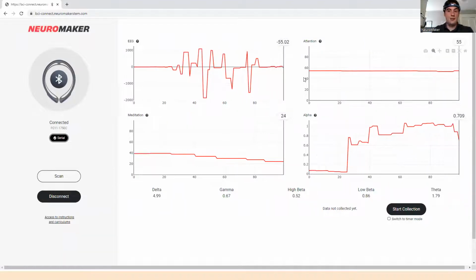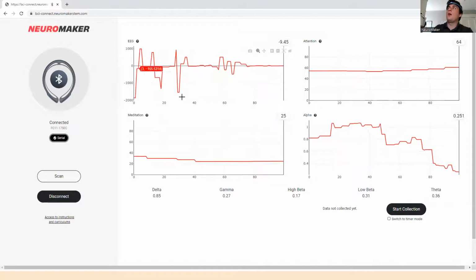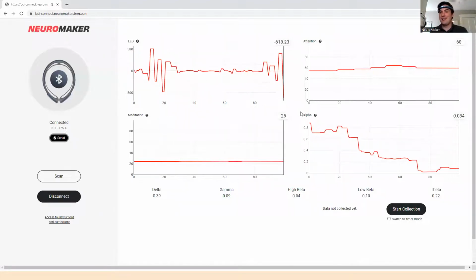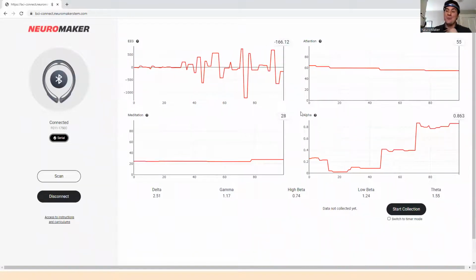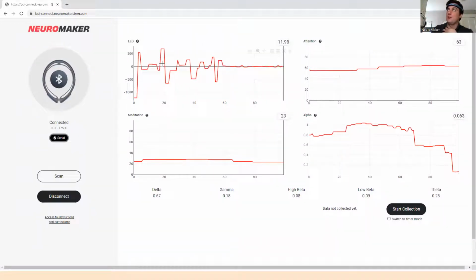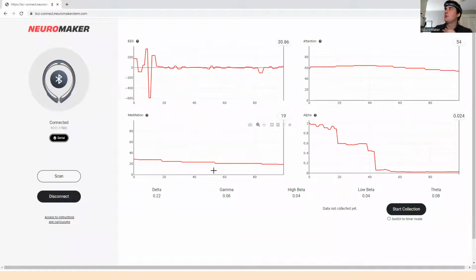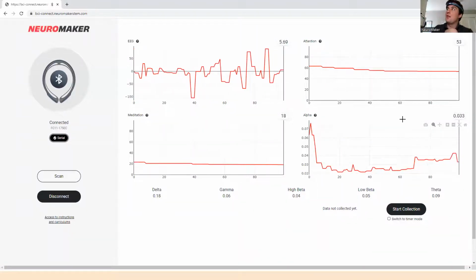So you can see there, you can see some distinct eye blinks, right? So there's all kinds of signals coming up in here. Of course, nobody's going to look at this and say, oh, I know exactly what's happening. So that's where we've spent a lot of time working on this technology to make it a little bit more presentable. We've taken these raw signals and turned them into things that are a little bit easier to use. For instance, I talked about alpha waves a second ago. Here are just those alpha waves.